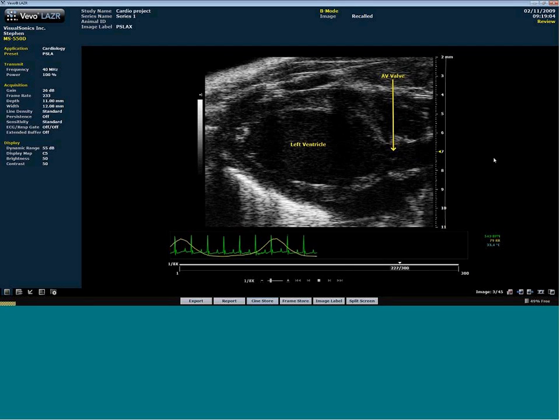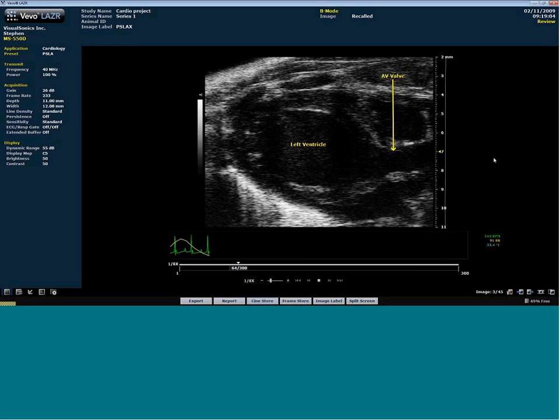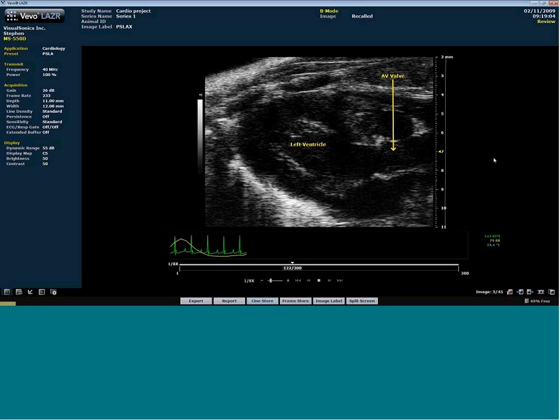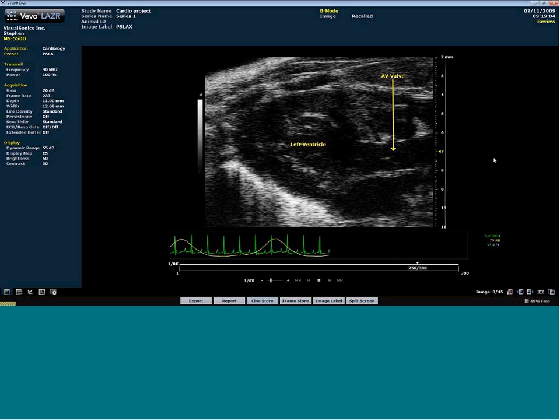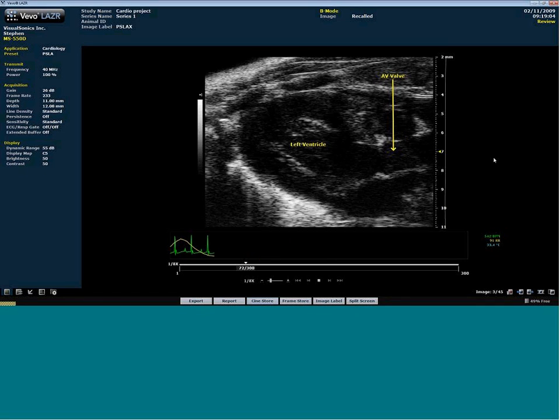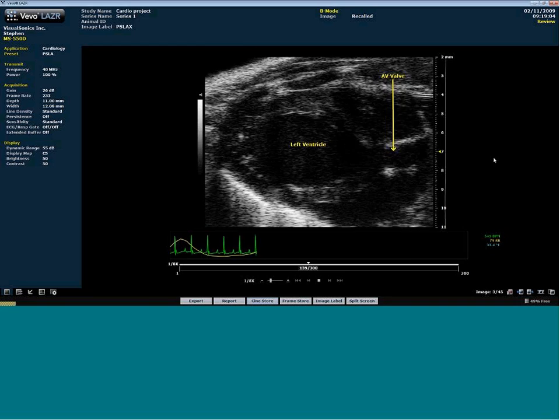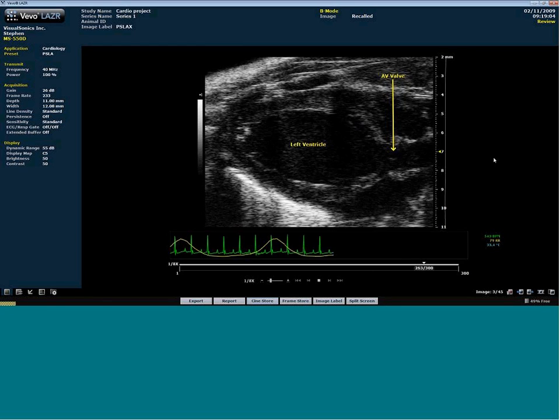That just comes from animal positioning, from using the rail system, using the table, the ball joint underneath the table where the mouse is, to get proper angles and positioning. Now, these can vary a lot between animals, even between different species, or sorry, not species, but different strains.